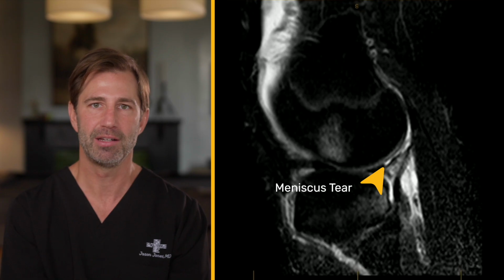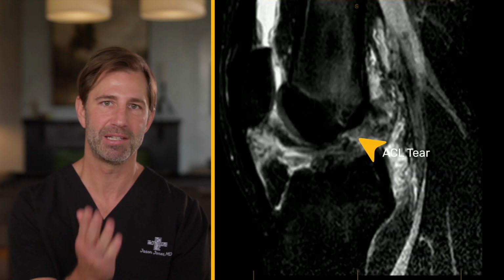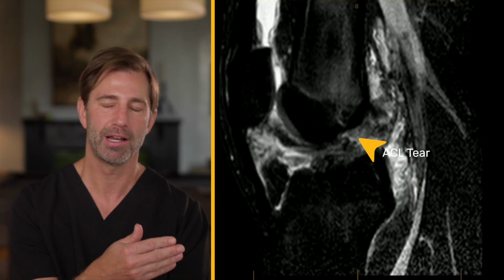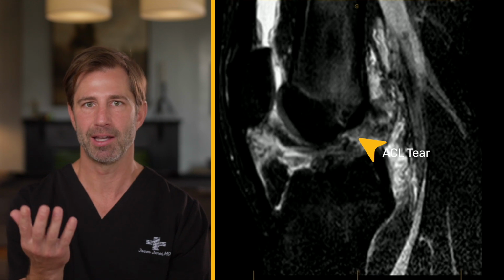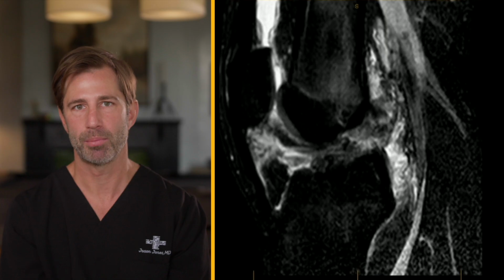Lastly, in the center of the knee, you see where the ACL should reside. Once again, we notice the PCL on the back. This is always a good comparison to what the density of a ligament should look like, but in this particular case, the ACL has this bright white signal, and that is compatible with a recent rupture.